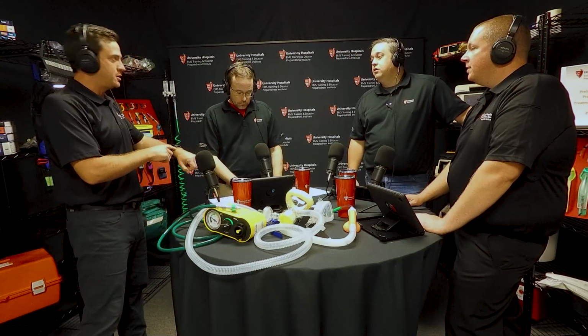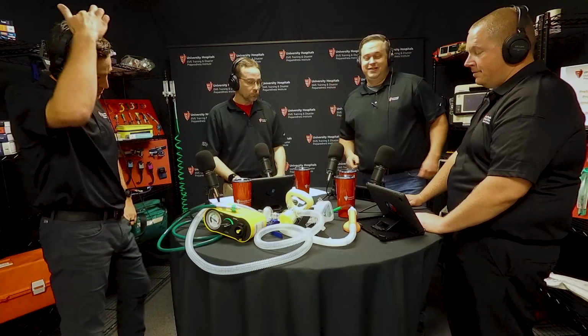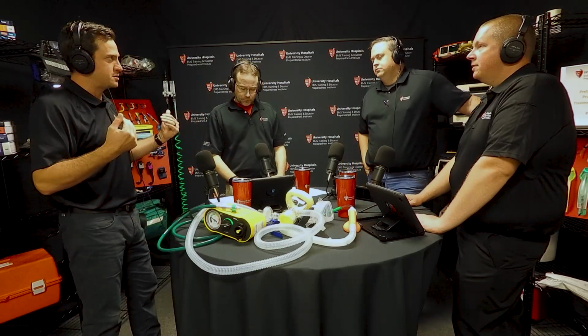I think a stethoscope should be as intimate to a paramedic as a pen or a wristwatch. They should have their own stethoscope. I agree. Get your own, a good one that works for you. I've done this with nurses in the past. I see crappy nurse ones and I say, here, listen with yours, listen with mine. They're like, oh my God, you can hear things. Now I'm going to do that with paramedics. Listen with your stethoscope, listen with mine. What do you hear? Why wouldn't you want the better tools? If we're in the back of an ambulance doing 60 miles an hour, what am I hearing? Road noise with that cheap stethoscope? Get the tools for the trade. Get the right stethoscope.